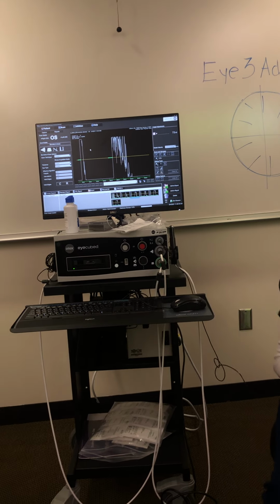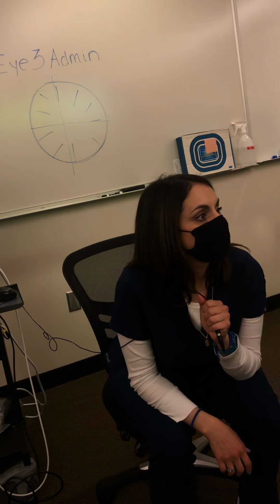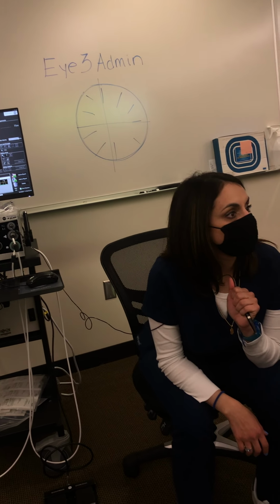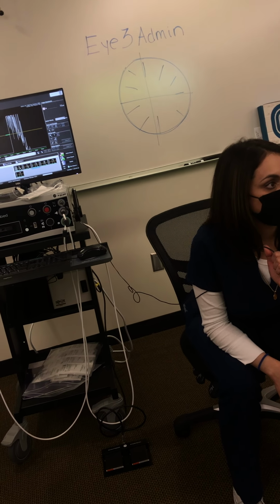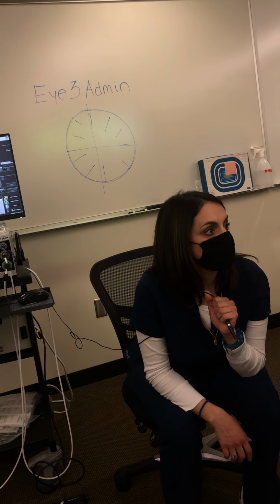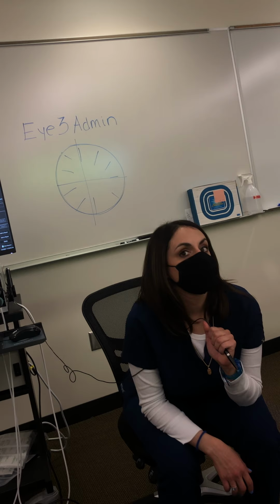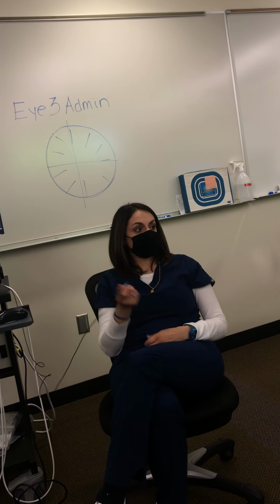When you put the whole thing on the patient's eye, I have two different techs who tell me different things. One says the patient should look straight ahead. For example, when they do the right eye, they have both eyes look straight ahead. But the other tech tells me that when you put the probe on the right eye, you want them to look at the red light. So if you ever have one of these done, if I do this, the red light is everywhere.